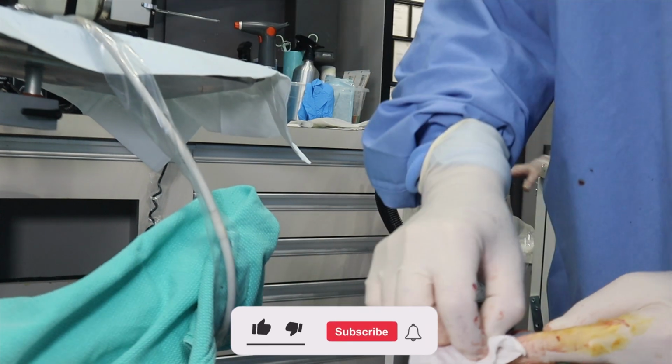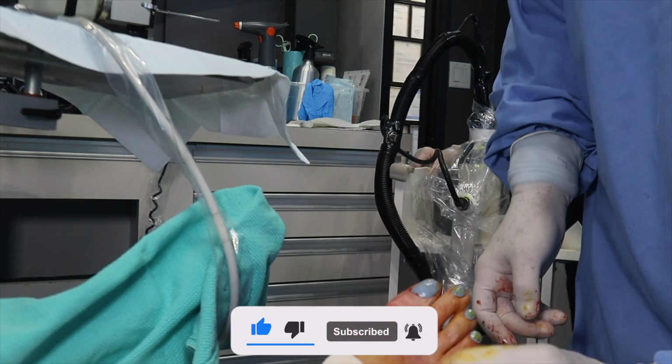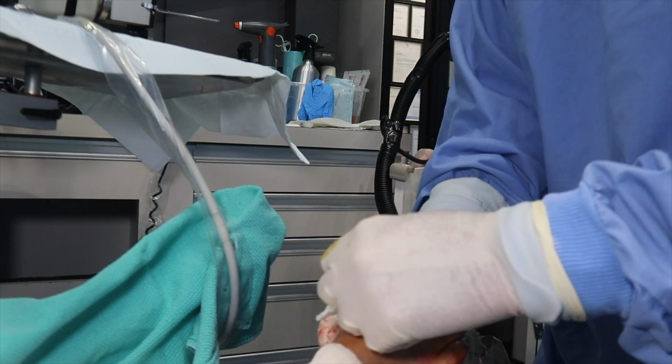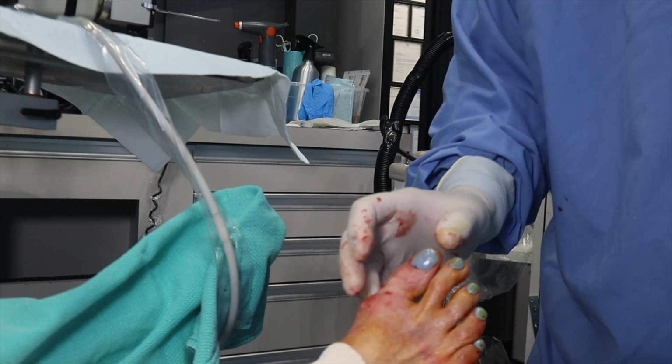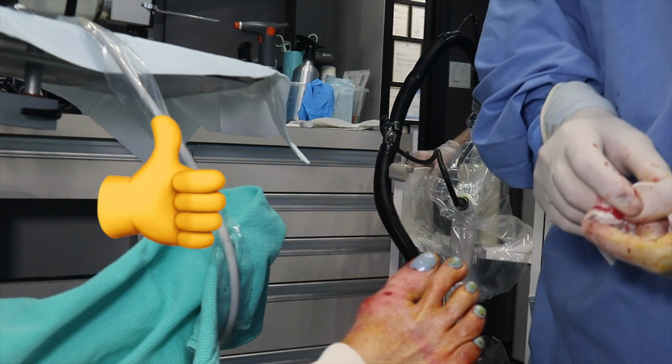Now let's see if the big toe comes over. Perfect. Nice and straight. No stitches. Bump is gone. Toe is perfectly straight. And we're all finished.